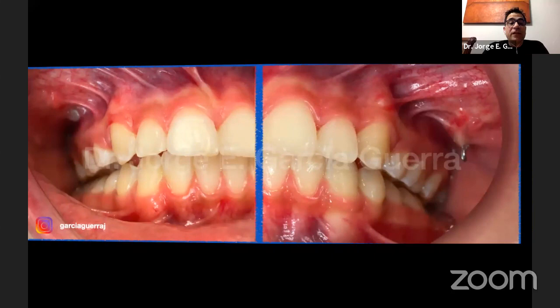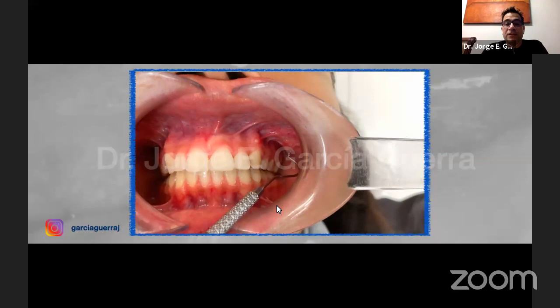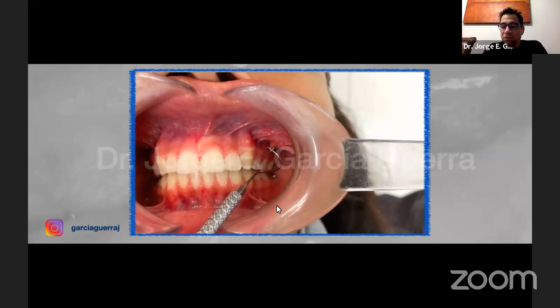And obviously, this is a failure, because for the removal you need to put anesthesia and open a little flap so you can remove the mini implants. Now, it's very important that we understand the insertion site so we don't have these situations with our patients. It's common that this happens, so we must not alarm ourselves a lot, but we need to try to avoid these situations, okay?